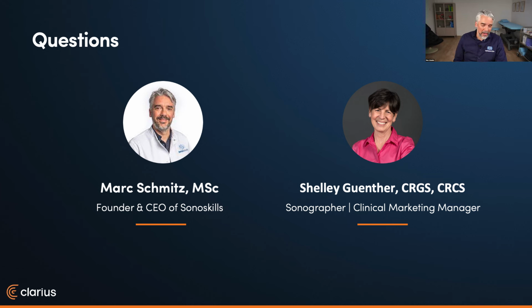Yeah. So, you know, ultrasound is easy to learn and hard to master. I think that if you come to the boot camp or follow other courses at other locations, the sonoanatomy is easy to learn. In a couple of days, also in this 2-day boot camp, you can learn lots of sonoanatomy. And then the hard part comes afterwards, when you need to learn pathology recognition. That you only learn by doing, not being afraid of making a mistake. Just do it, and we can help you with that.